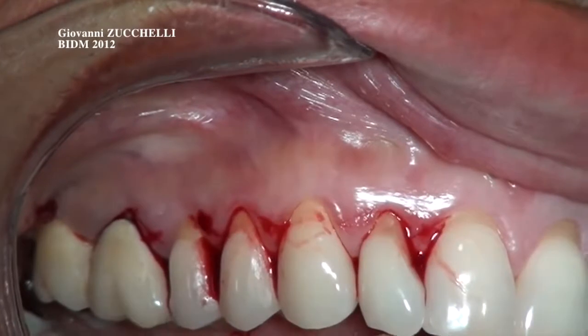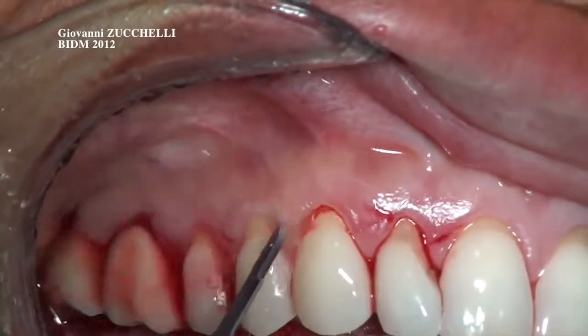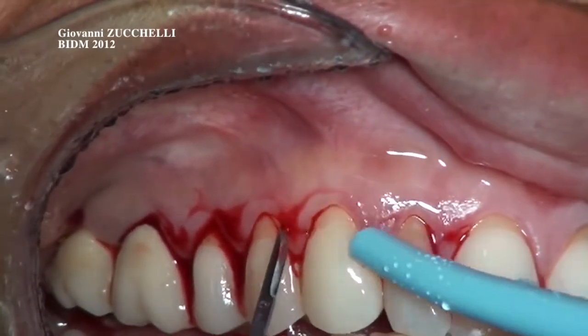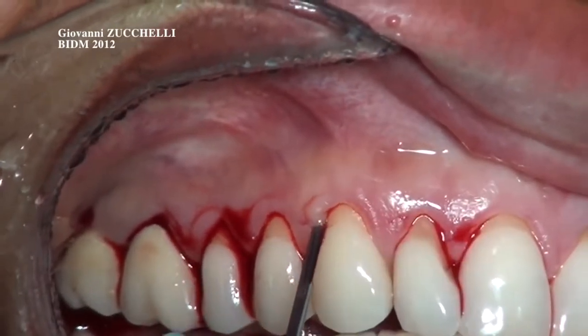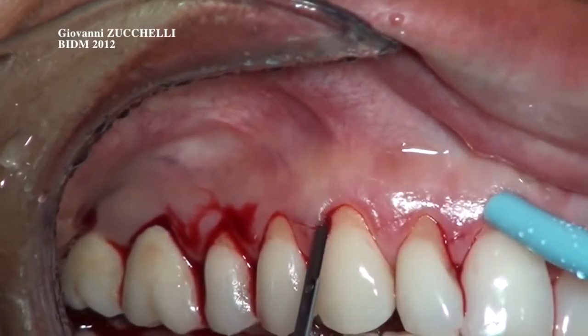Saline, please. Now what you have to do is to get in this incision line with your knife and start to elevate the surgical papilla. Every single surgical papilla must be elevated split thickness.